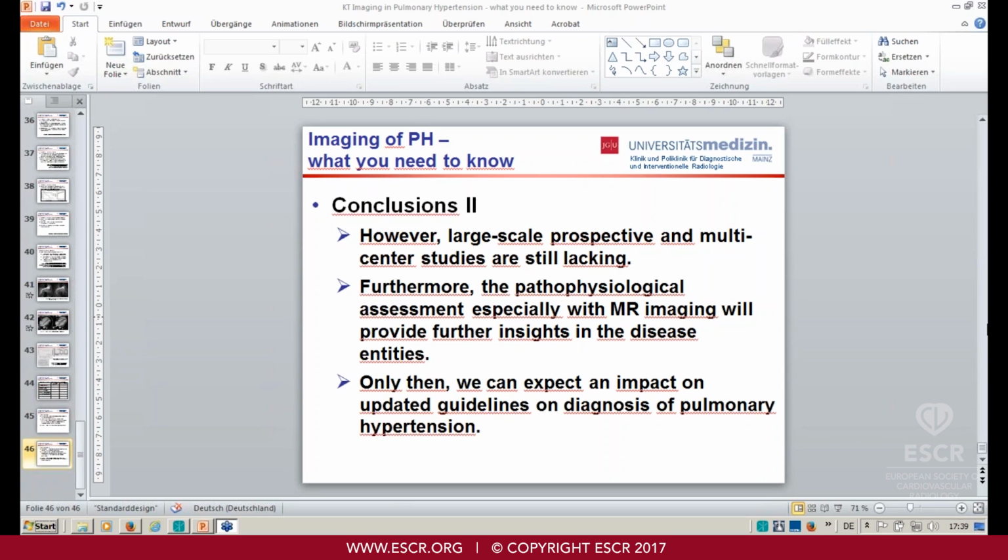Well, I perform MRI nearly in every patient with pulmonary hypertension, especially if we want to assess non-invasively, get some information about the mean pulmonary arterial pressure. I think this works very well with MR, even with 2D imaging. So it's not necessary that you have a 4D imaging package available with a considerable amount of post-processing time. Well, I think this is the most important reason.